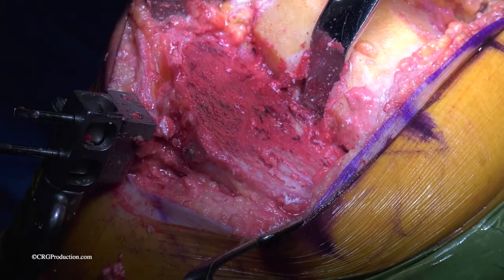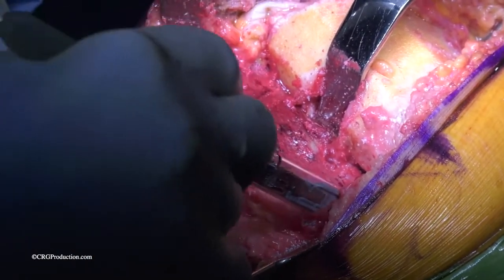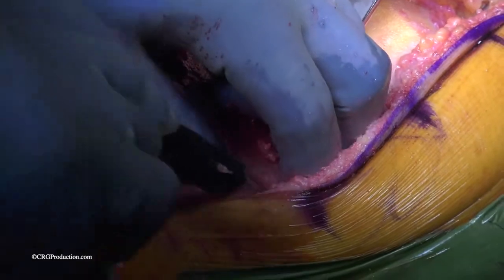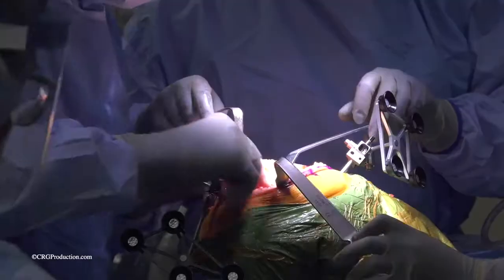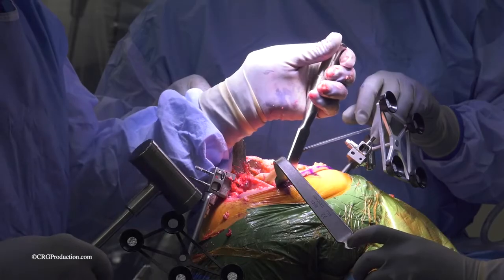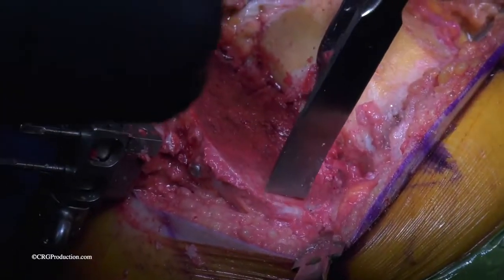So now we have the top of the tibia all set up, making sure we know exactly the edges. What we have to do is truly make sure that the prosthesis will sit on solid bone and not on a bone spur. In this case, there may be some bone spurs there along the edge of the tibia, so the curved osteotome is used, and some of the bone spurs are removed again.